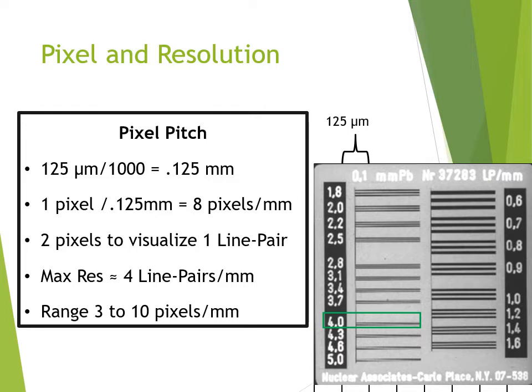To demonstrate very small structures, the pixels must be different densities, to possess the characteristic we call contrast, and this is where histograms come in. The histogram is a quantification of all the density values on a single image. I know I said this would be easy to understand. Please bear with me.